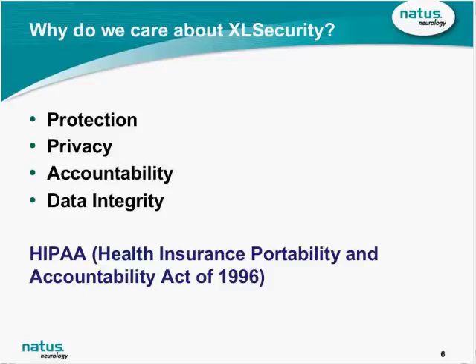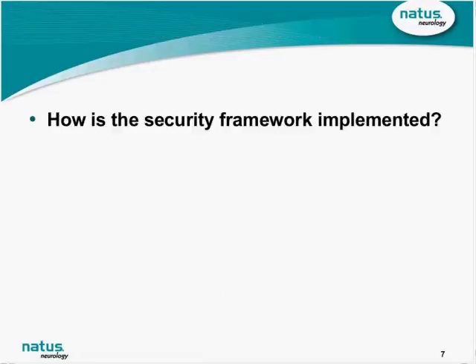We provide you with the tools. It is up to you, the end user, to utilize the tools that we provide to make your lab HIPAA compliant. Or if you don't necessarily care about HIPAA compliance, it is up to you to implement measures that will help you protect your data, maintain privacy, and hold people accountable.